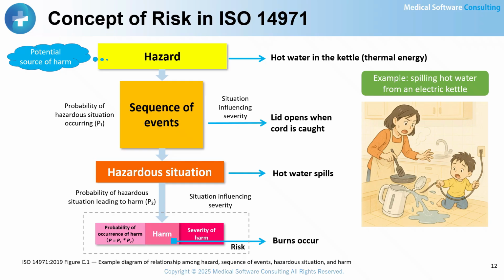the potential source of harm. However, it is not difficult to imagine that if software malfunctions, it could lead from a hazardous situation to actual harm.